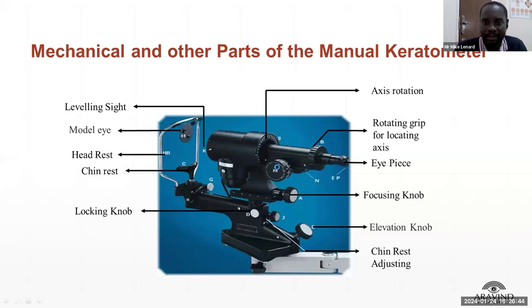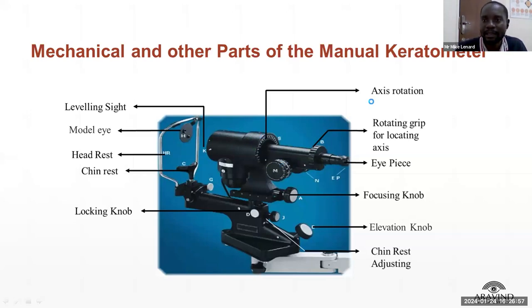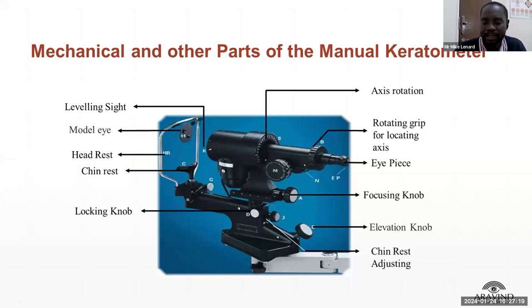There are two drums — one for horizontal and one for vertical meridian, to measure the curvature of the cornea. Other parts include the rotating grip axis, a leveling site, and the model eye used for calibration. There is also a head rest and chin rest. Those are the main mechanical parts of the manual keratometer.